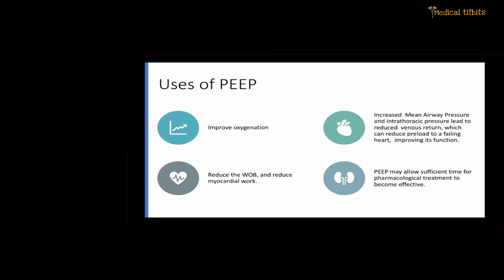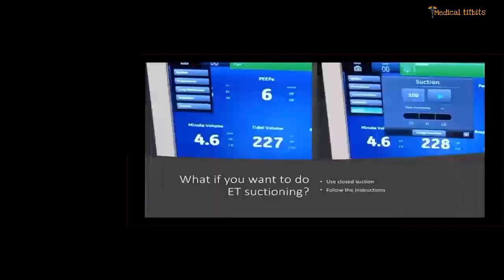We are keeping the lung units as much open as possible to expose maximum alveolar surface for gas exchange, so that by the time your diuretics and other drugs drain away the excess water and reduce the lung congestion, we can maintain oxygenation. So that is the idea.